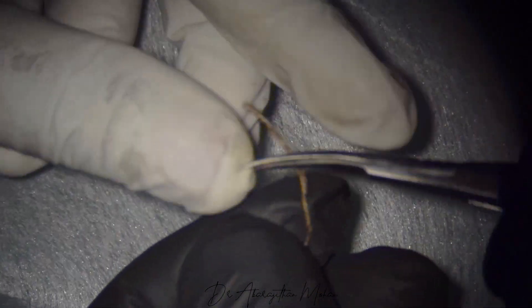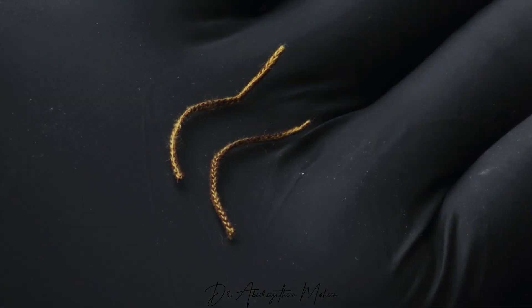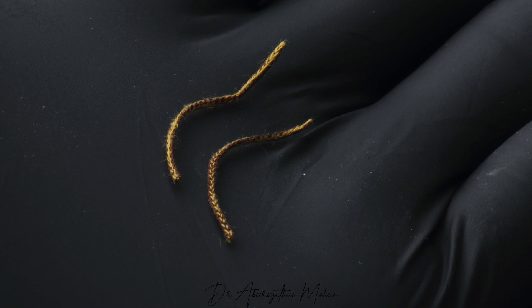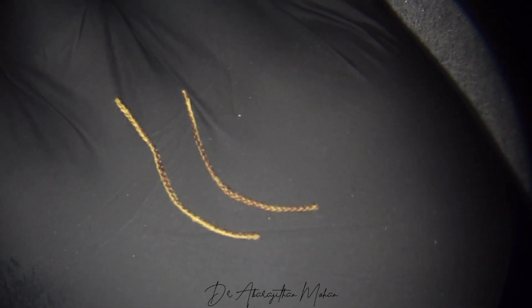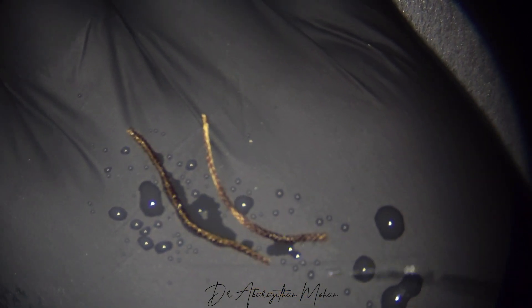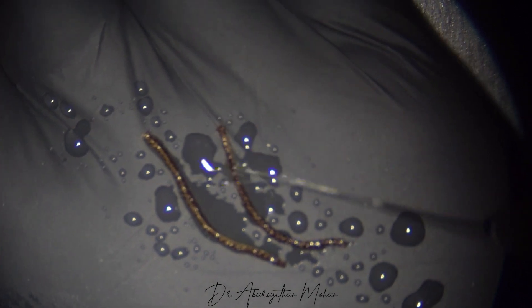You can see here the amount of displacement. I'm going to take roughly an inch of the double zero retraction cord, which is good enough for one central incisor. I'm going to place it on both the central incisors before doing the preparation. It is very important to wet the retraction cord — you can use any solution; even saline would do, but here I'm just using the local anesthetic solution to wet it.